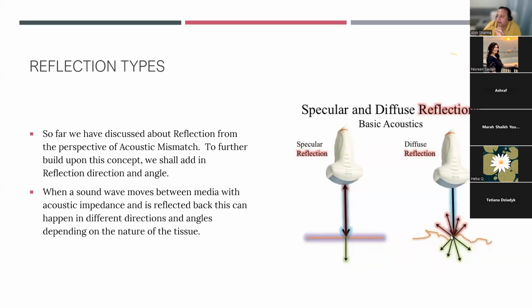But if you have irregular tissue, a classical example that I'll give you is if you've got a pneumonia with breakdown, the margins of that pleura, which is kind of moth-eaten, is going to be quite irregular. You're going to get reflection, but it's actually going to give you a lot of attenuated sound waves, which have kind of refracted back. Sound waves that go in will interact with tissue in a different way.